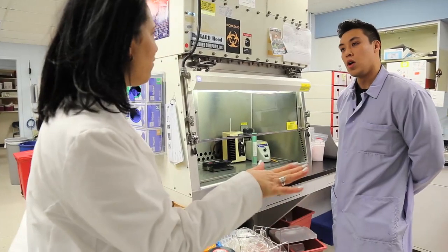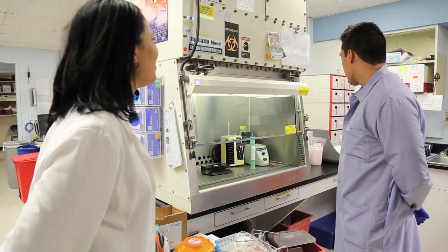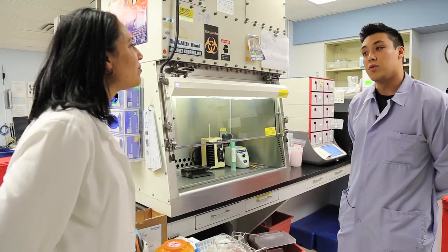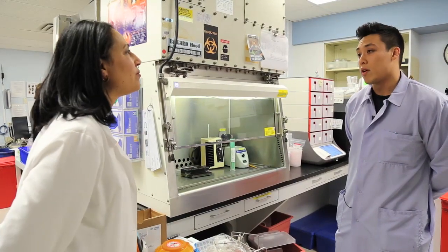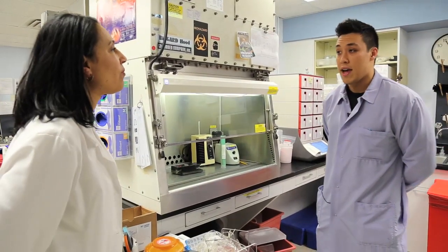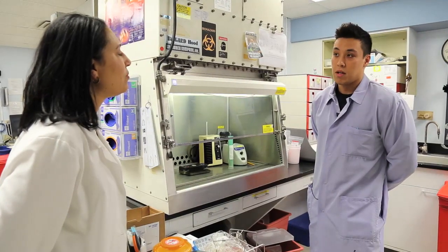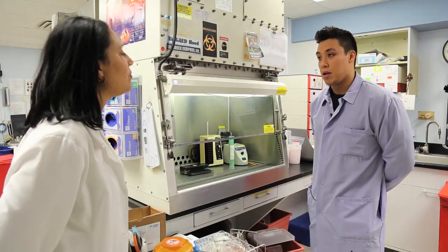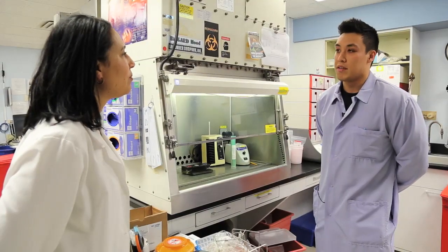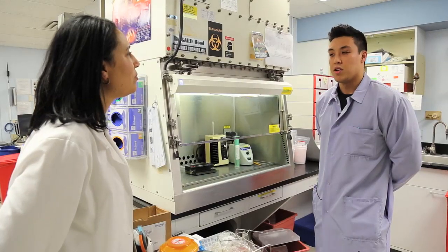So this is the BioFire station, right? Yes. So what is BioFire? BioFire is a company that runs PCR method testing to rapidly determine whether or not a patient might have various pathogens. We do different assays with BioFire, one being the respiratory panel. We have a stool PCR panel, a blood panel, a meningitis panel, and there are more things to come. So it's an up-and-coming, fairly new, good system.